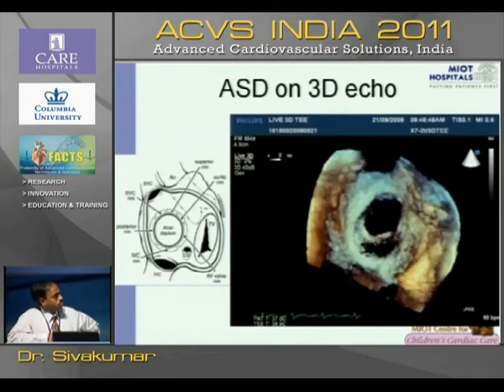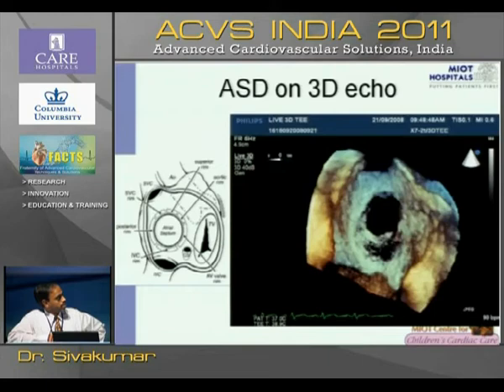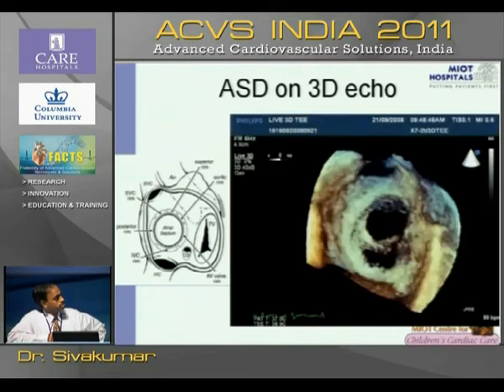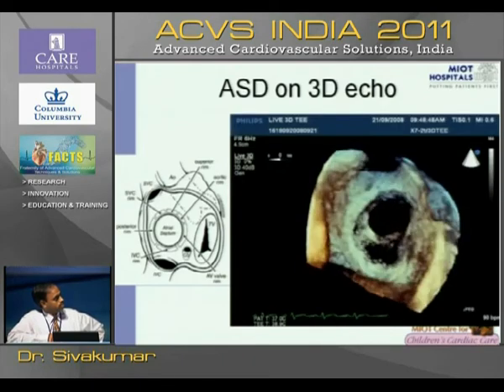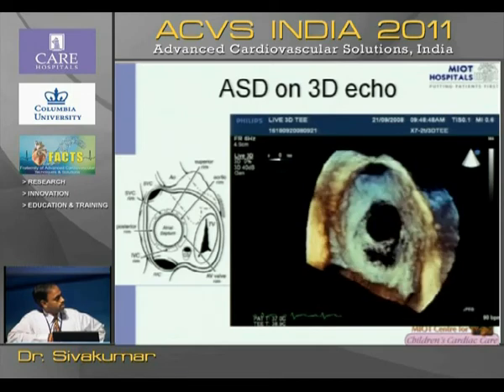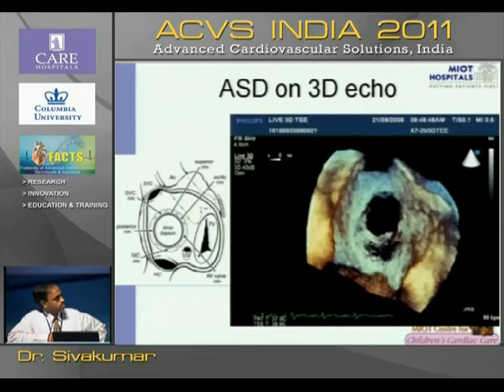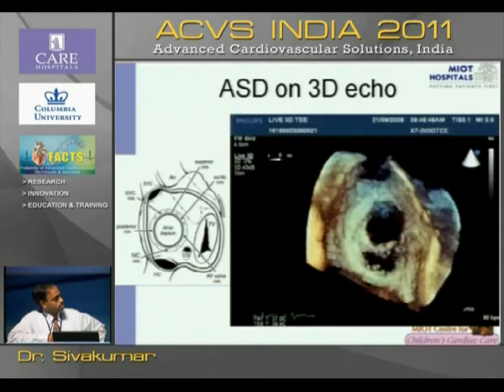This is a similar view, a 3-dimensional echocardiogram. The same chopping off of the right atrial free wall has been done. What is visualized is the superior vena cava, the inferior vena cava, the limbus of the fossa ovalis, a fossa ovalis ASD. You see the aortic valve leaflets here, and this is the aorta, so this becomes the anterosuperior retroaortic margin.